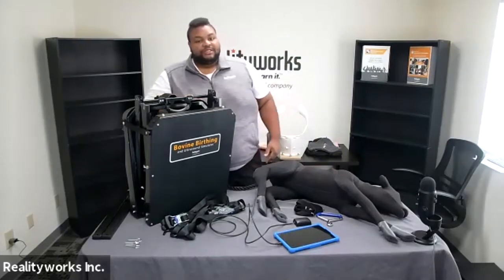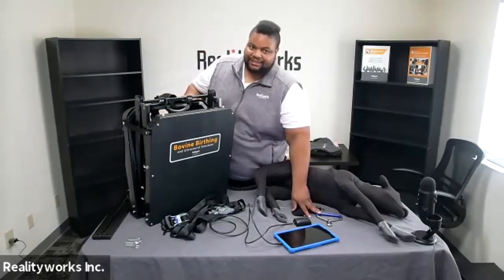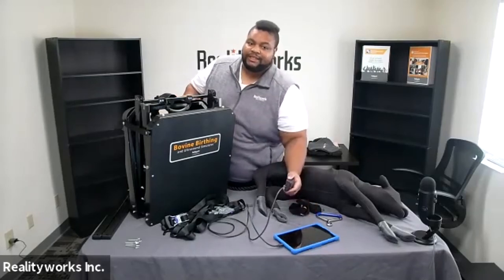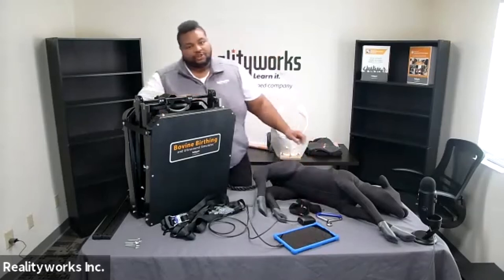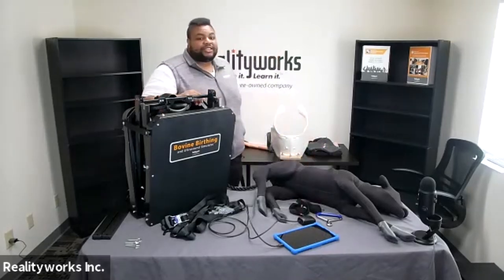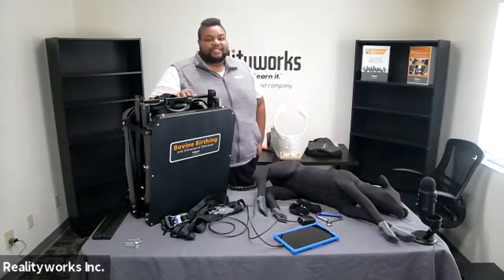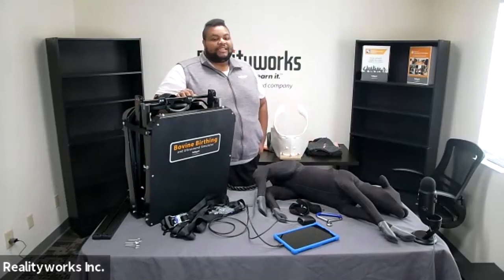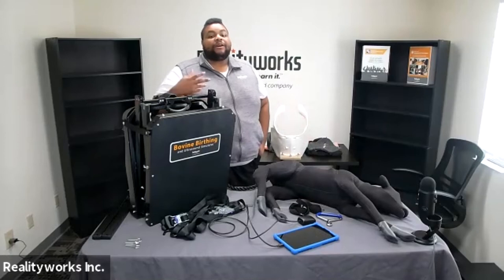You have birthing tools, straps, handles, an ultrasound simulator which is the tablet and probe that comes with it. There are storage bags for both the tablet and probe and the unit itself. It comes with a one-year warranty, and you have full access to our online bovine birthing and ultrasound curriculum that comes with the unit as well.